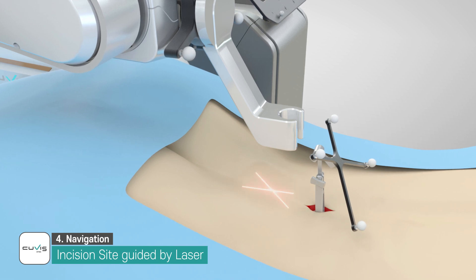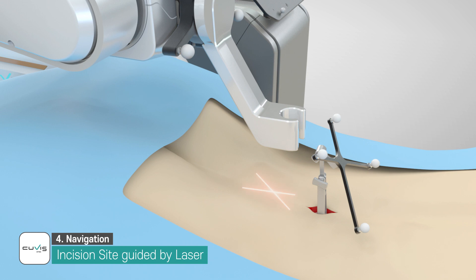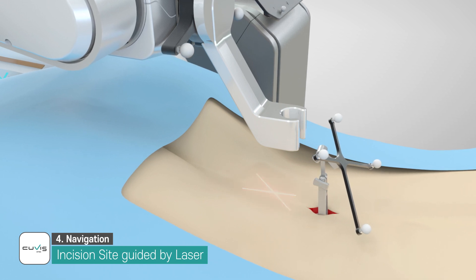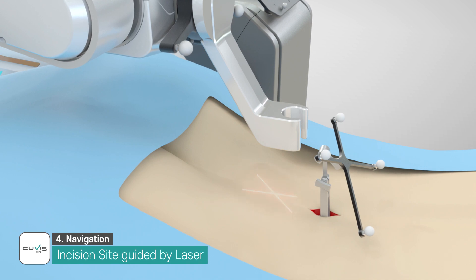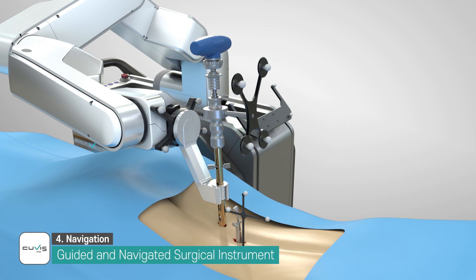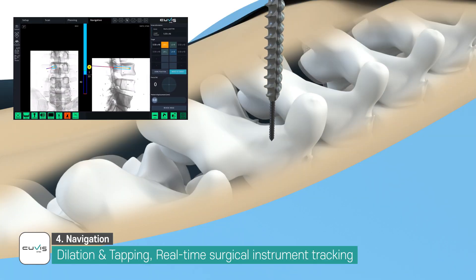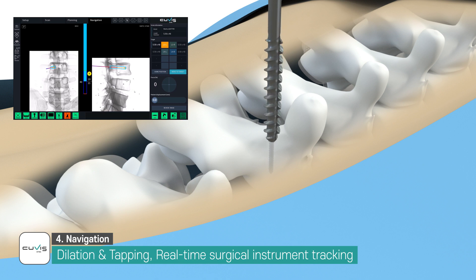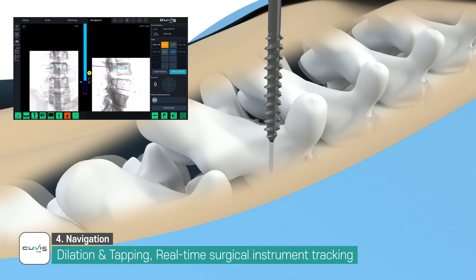The insertion point of the surgical instrument is indicated by the intersection of the guide lasers and can be used as a small incision site of the skin in percutaneous surgery. The sterile guide bush is mounted and the surgical instrument is inserted through it. Wireless one-step surgical instrument allows tapping to insert pedicle screws. The embedded stylet minimizes the skidding of surgical instruments on the bone surface.